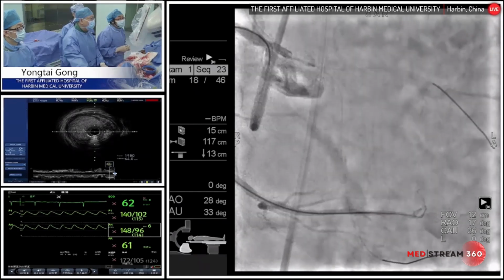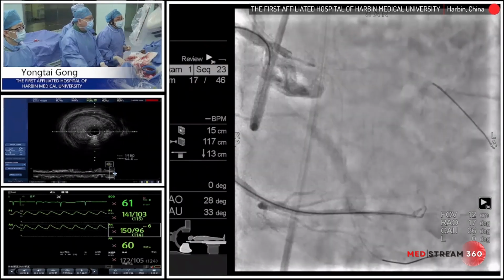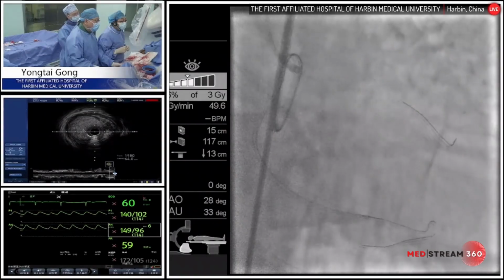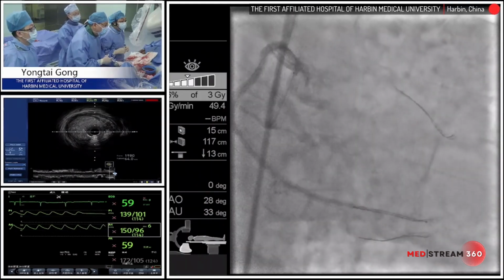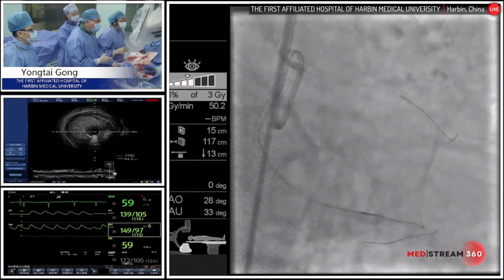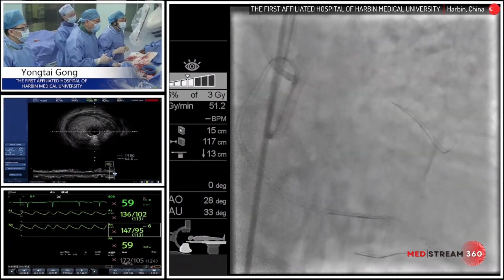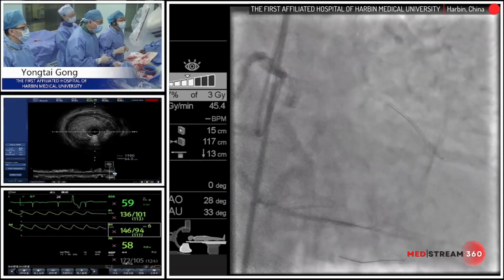So you need to make a very sharp turn after you go through the septal branch, which is a relatively difficult choice. I think the most often used is 0.8 millimeter or 1 millimeter with a relatively shallow bend, something like 20 to 30 degrees, although some operators use 90 degree bends to allow tracking of very small, sharply angled tortuous collateral flows. I think this is of key importance.